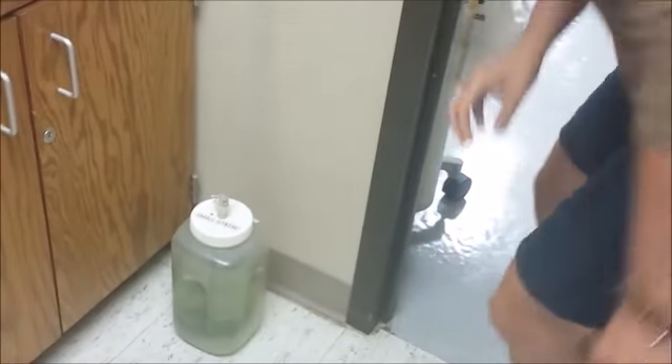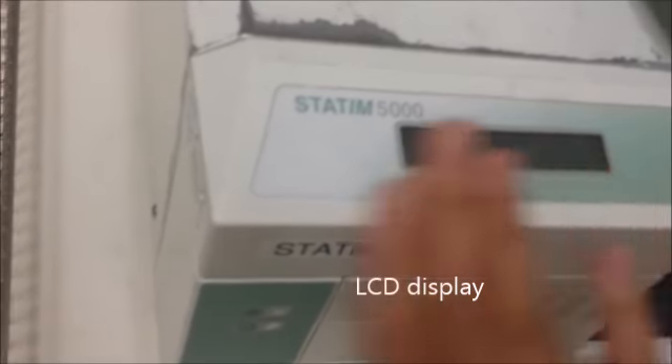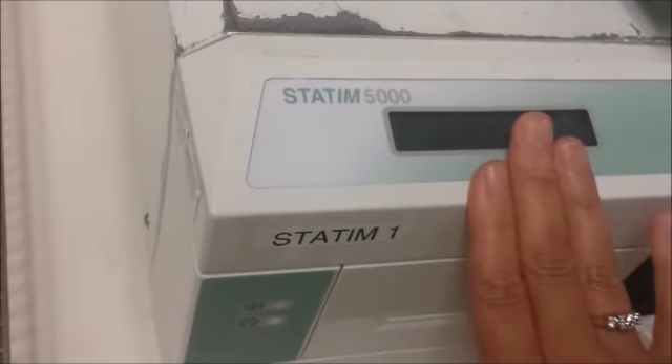Your LCD display is right here. This is going to tell you what cycle you're running, if it's complete, and things like that.